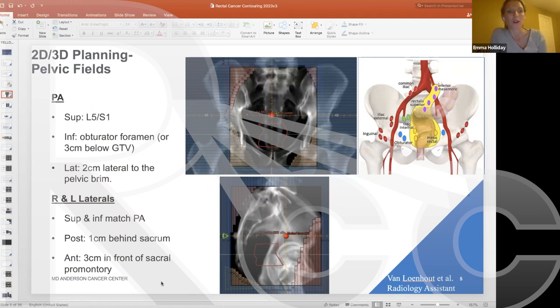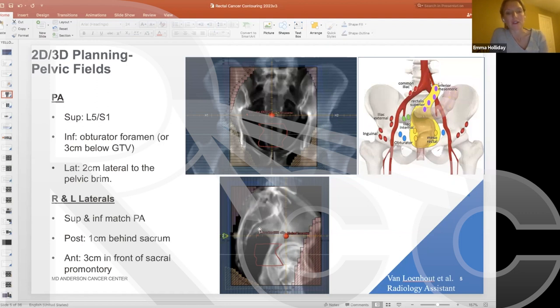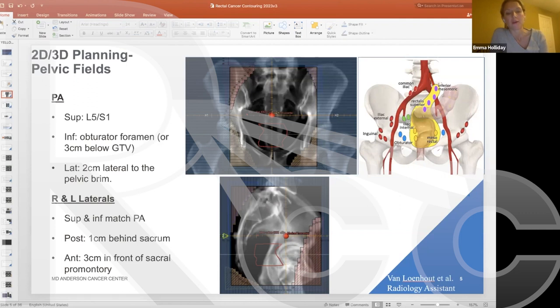The classic field borders for the PA beam: the superior border starts at L5-S1, the inferior border goes to the bottom of the obturator foramen or 3 cm below GTV, and lateral borders go 2 cm from the pelvic inlet, with corner blocks for the femoral head and bowel. For the laterals: the posterior block goes 1 cm behind the sacrum, and the anterior border is placed about 3 cm in front of the sacral promontory, with corner blocks for soft tissue and an anterior block for bladder.